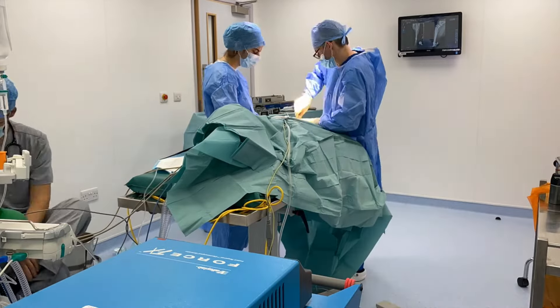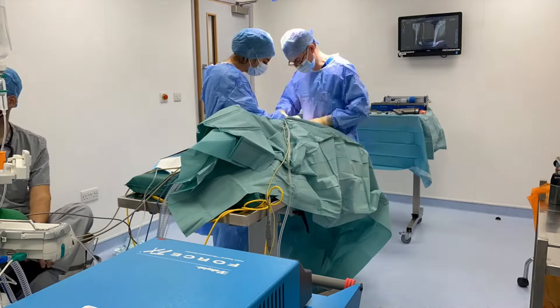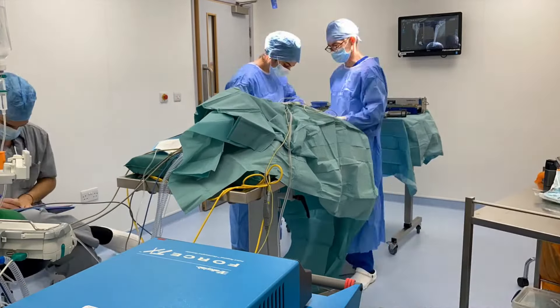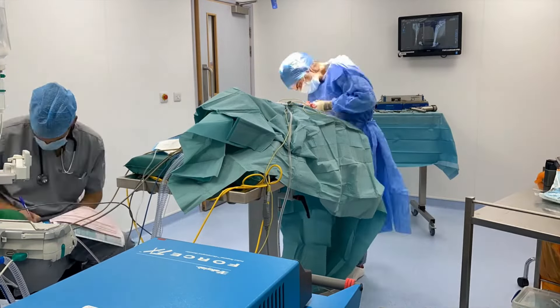This small dog had her joint inspected via a mini-surgical approach. The choice to magnify the view using a camera called an arthroscope is surgeon-dependent. Arthroscopes give a panoramic view, but the trade-off is more time under anaesthesia.